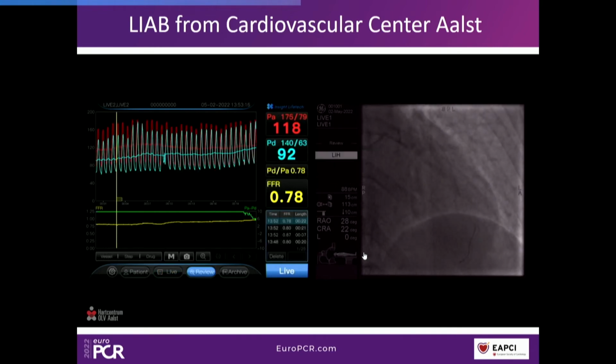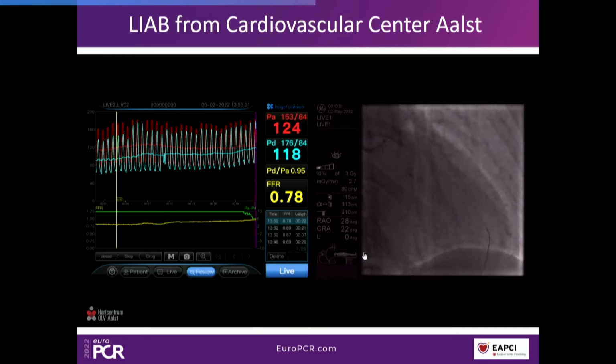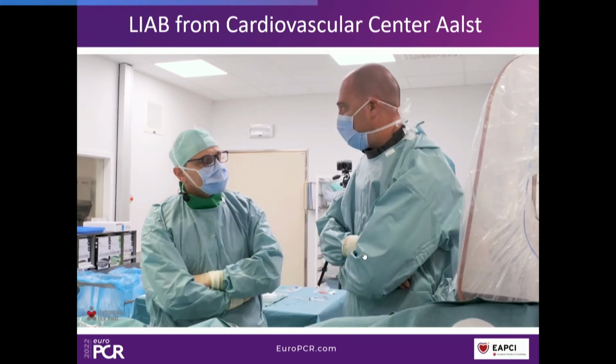Okay, now is your gradient. If you move it a bit, click on that one, to check. At the end is 0.96. Okay, there's a small drift, but it's diffuse disease, so we stop. Okay, so thank you, everybody.